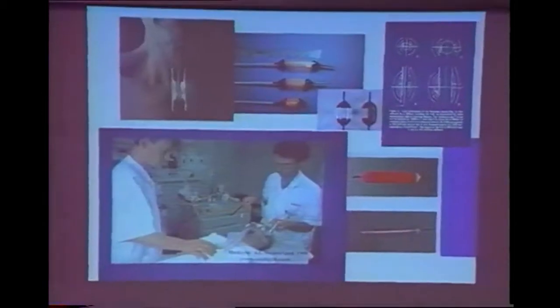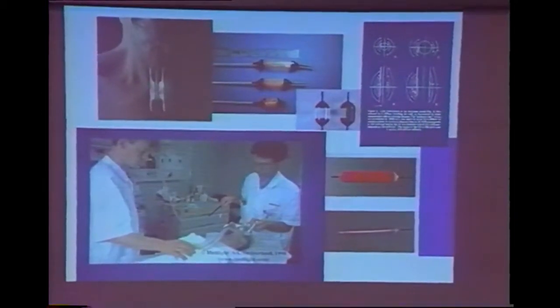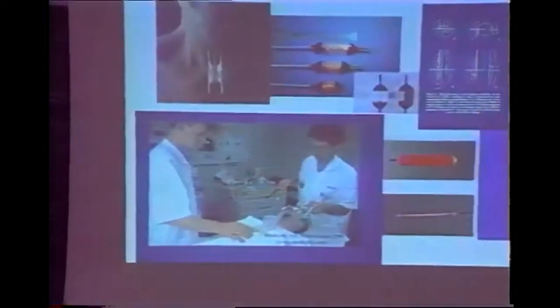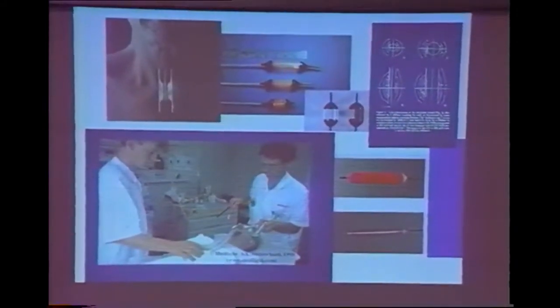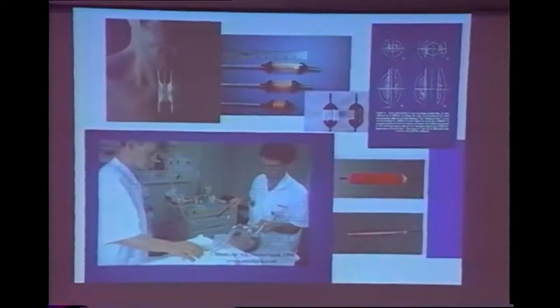As well as the diffusing fibers, a number of groups have developed balloon devices. So here's a balloon device for the esophagus, so that this balloon collapses, goes through the endoscope instrument channel, and then is inflated with air or with water, and then once it's inflated, you insert a diffusing fiber through the center, and these come in different lengths. You can shield one side if you just want to treat one side, for example, of the esophagus. Again, these are commercially available.